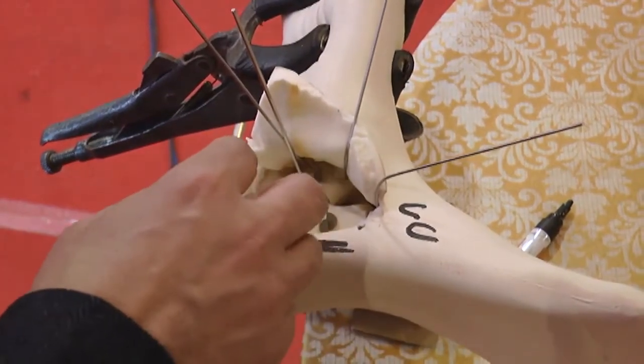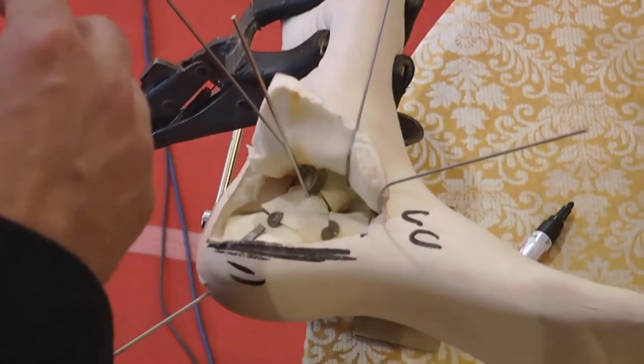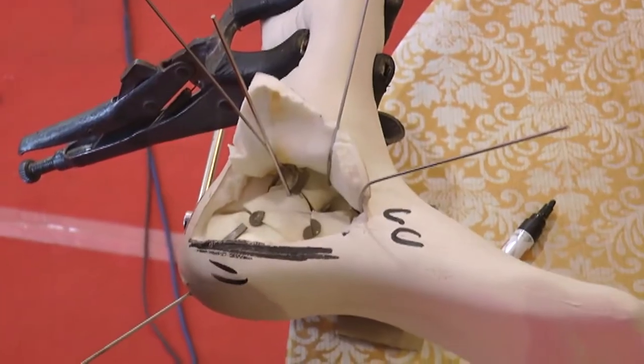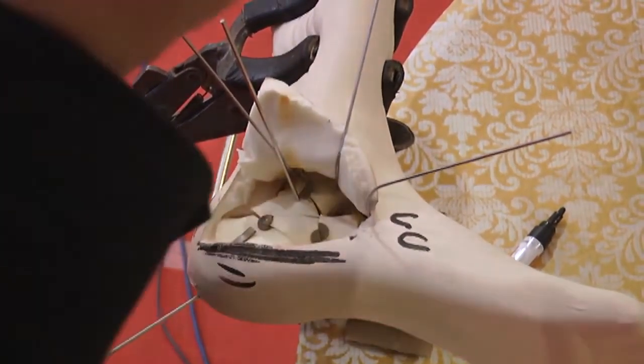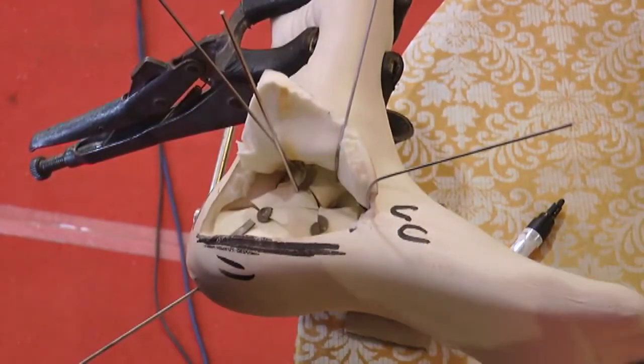You can actually crush the lateral wall blowout and put it in the void which has been left by lifting off of the lateral facet. So there's a big void. It does not require a bone grafting, but I prefer to crush the lateral wall and put it in the void. And the next step is simple, to put the plate.